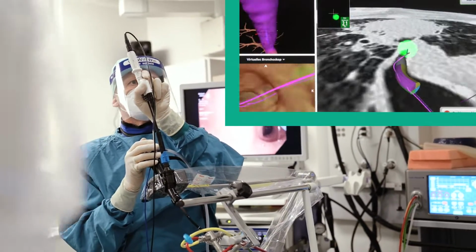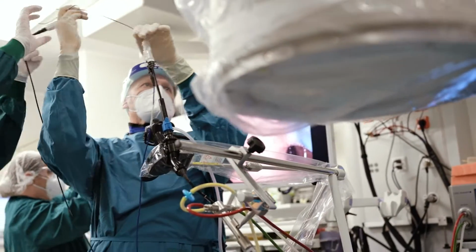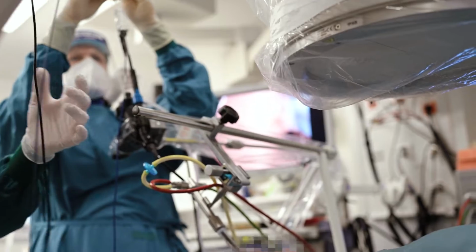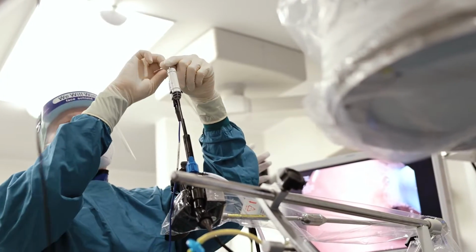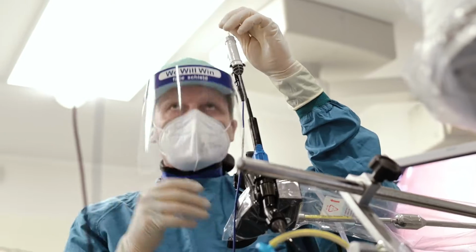They use a bronchoscope with a working channel of 2.8 millimeters. Since the distal end of the extended working channel includes a navigation probe element as well, the lesion can still be visualized by the system after extraction of the navigation probe. Radial EBUS serves to confirm the position of the lesion.